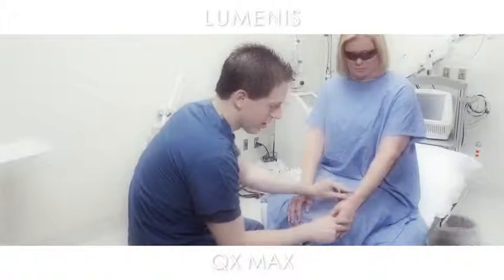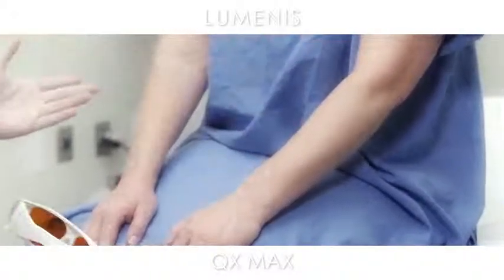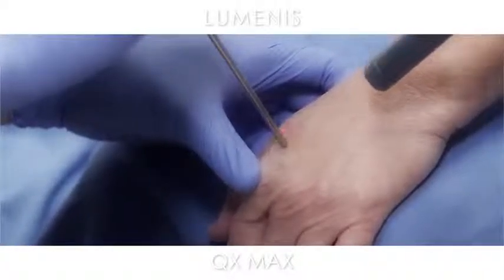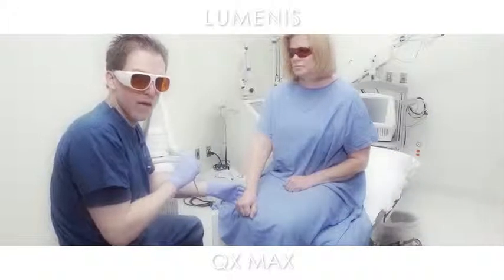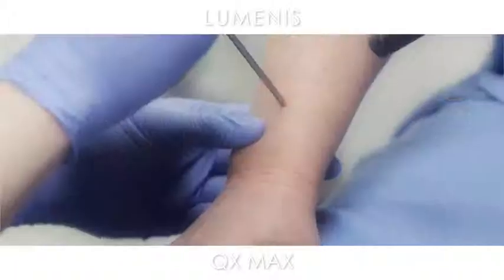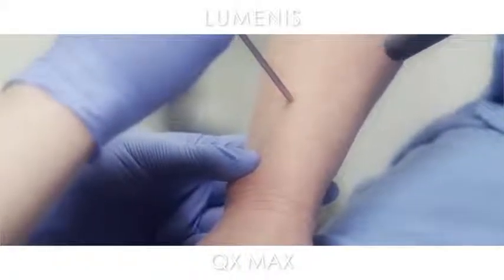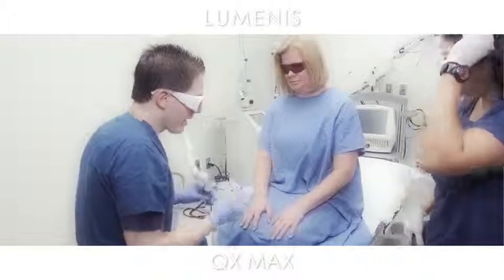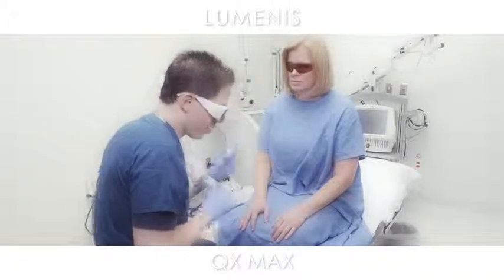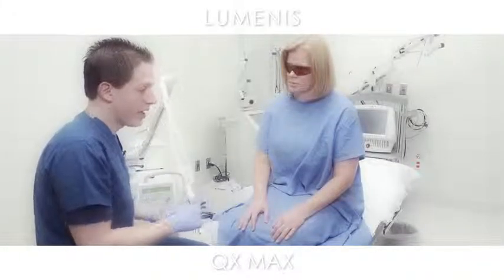So we're going to be targeting these little lentigines that she has on her forearms. She has scattered, tiny ones, and it's a very quick, very painless procedure. And you can hear the difference in areas that have a lot of pigment and areas that don't have much pigment — the popping sound gets much more dramatic. These areas will get very crusty. Rarely they'll get a small little blister forming and they'll come off over the next week or so. There shouldn't be really any pain afterwards. It should be a very comfortable procedure.